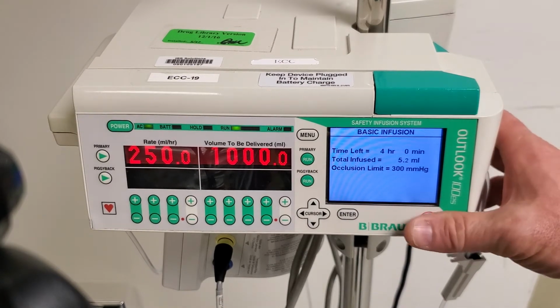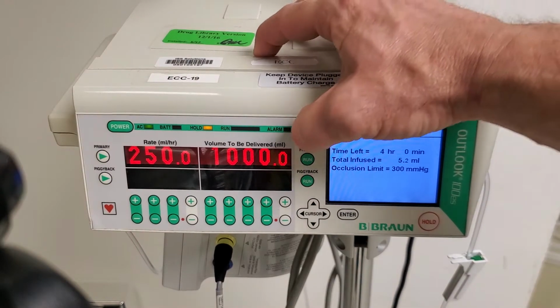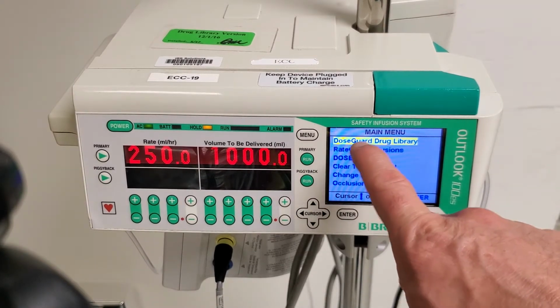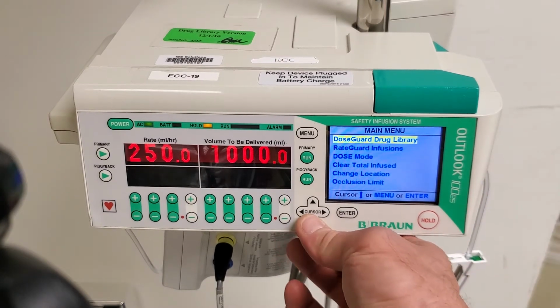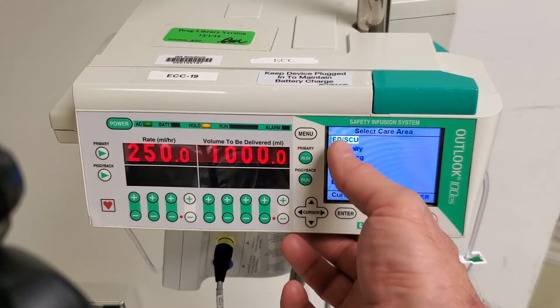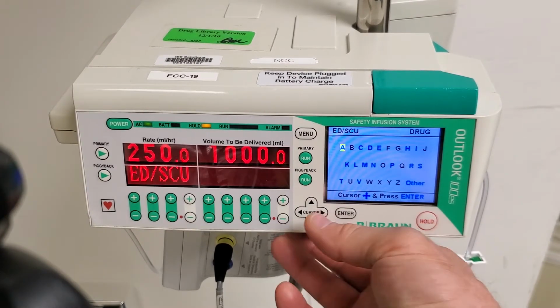Now, if we're delivering a drug that has to have dose calculations, we'll use a different menu choice. The two main options are dose guard or rate guard. This pump is set up so that many of the drugs are in dose guard. So we'll select dose guard. We'll select the relevant unit, typically the ED. We'll have everything you need.